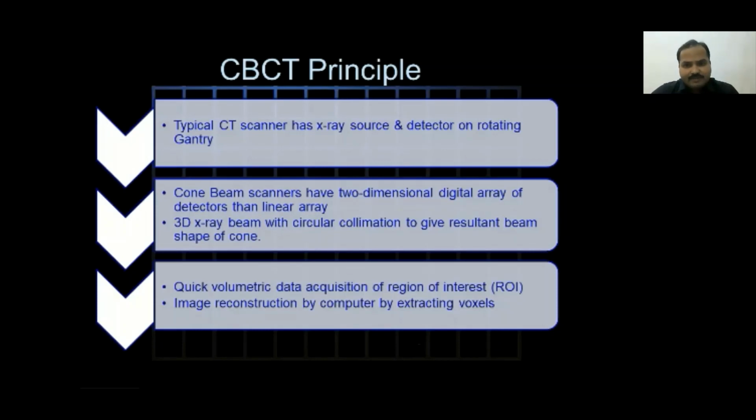So as we have studied in the intraoral periapical radiography and its machine, collimation is done through a lead-lined tube in that machine, where we need the area of interest, because the region of interest for an IOPA machine will be the tooth. We don't want any excess radiation exposing much more tissue than the tooth and its adjacent tissues. In this case also, for the beam to be in the form of a cone, we need a circular collimation.